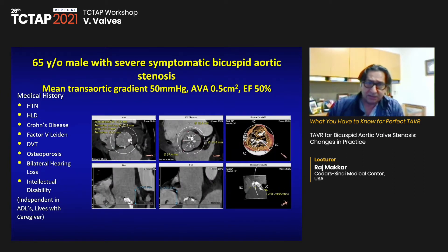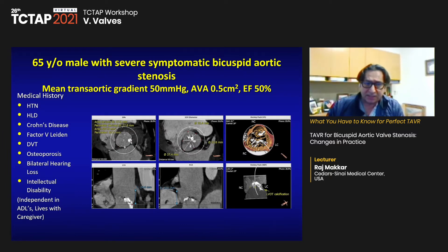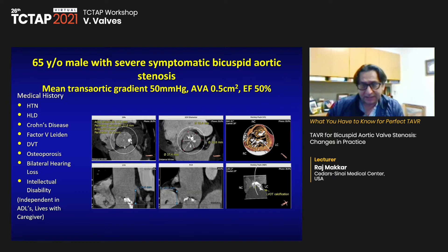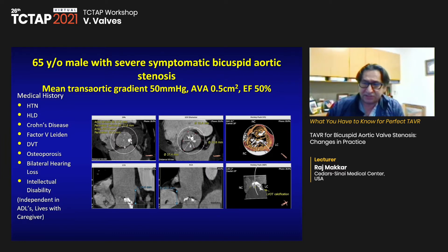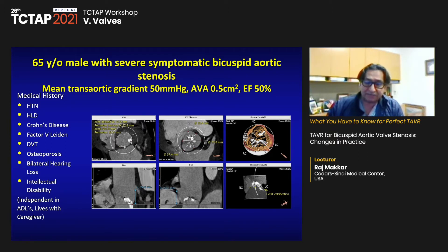Here is another 65-year-old patient with significant comorbidities. The coronary height was substantial, almost 24 millimeters, and the annulus size was 597. We thought he could get a large valve and potentially TAVR-in-TAVR in the future because the coronaries are really high.